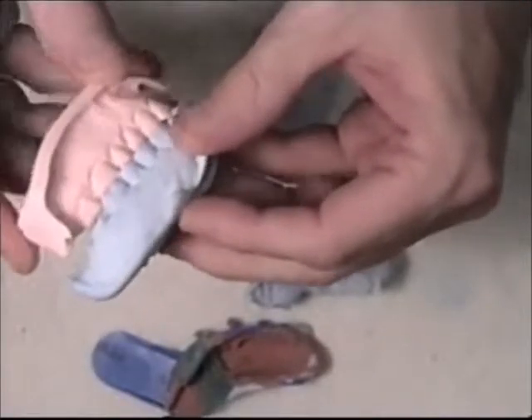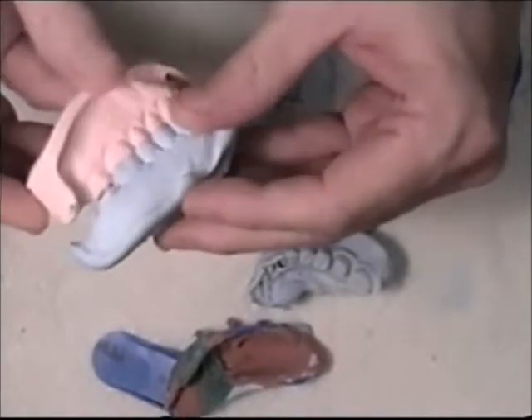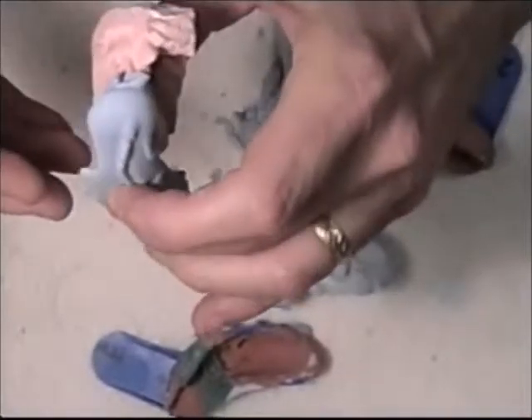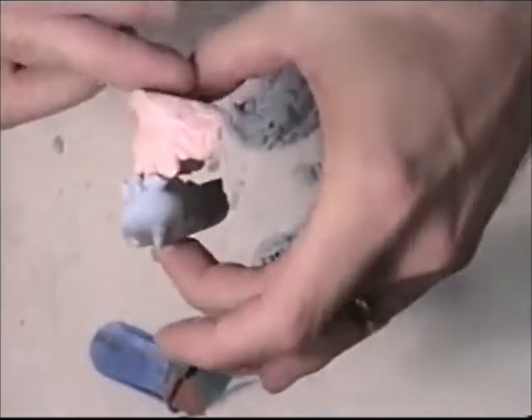We will hand articulate the best we can, and use a bite if we need to if we can't hand articulate it. Then we'll go to our model trimmer and level off the top and the bottom as best we can in this step. So that's what I'm going to move on to now.